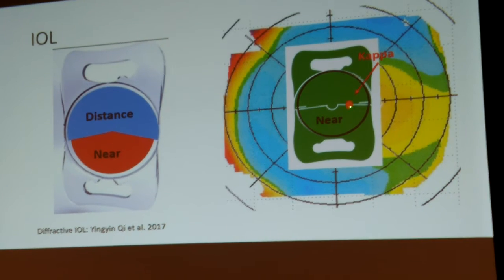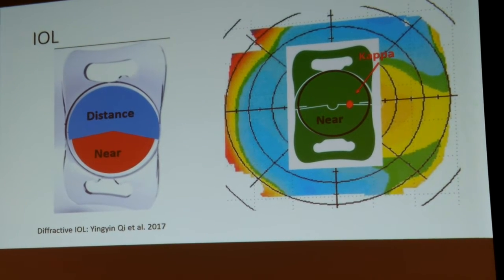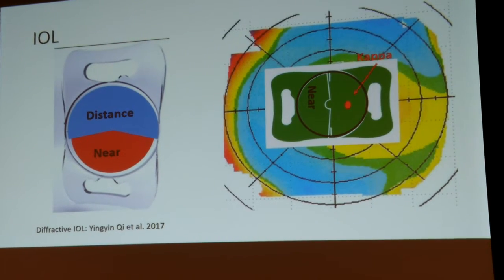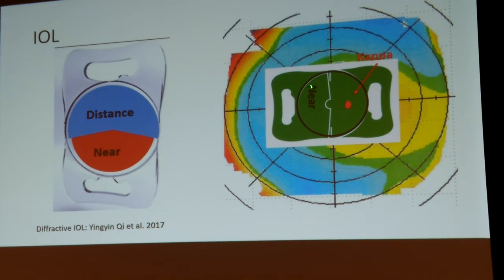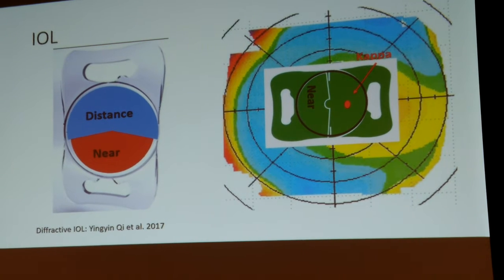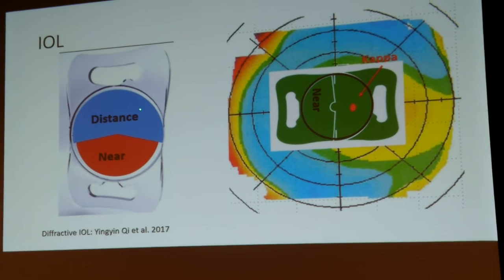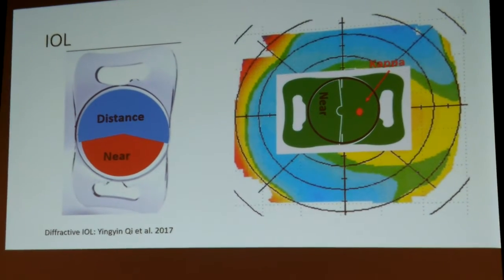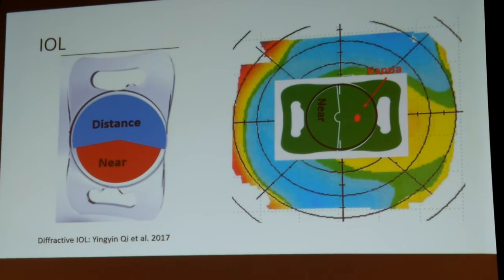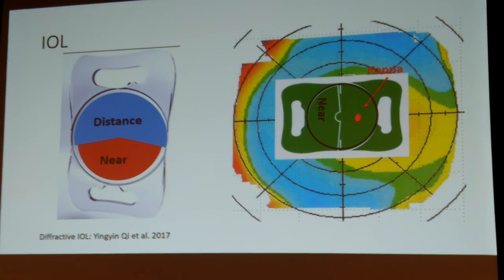The patient looks right at the angle where the transition zone is. So what we do then, we rotate the lens and implant it with the near segment somewhere else. And with the segmented lens, it's quite nice because you have the choice where you place it. Whereas if you use a diffractive lens with these ring segments, you can't. A ring is still a ring however you place the lens, it doesn't matter.